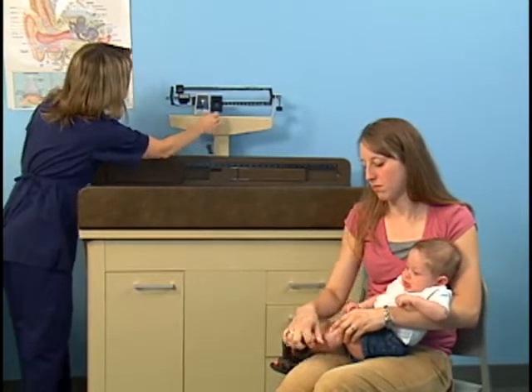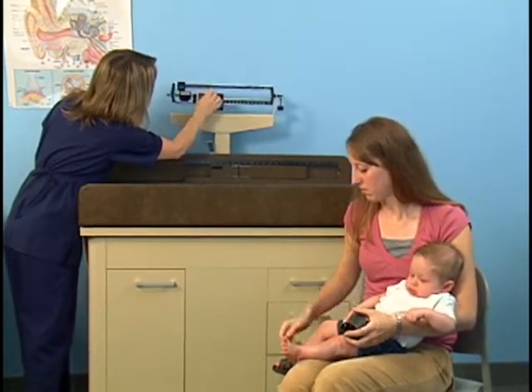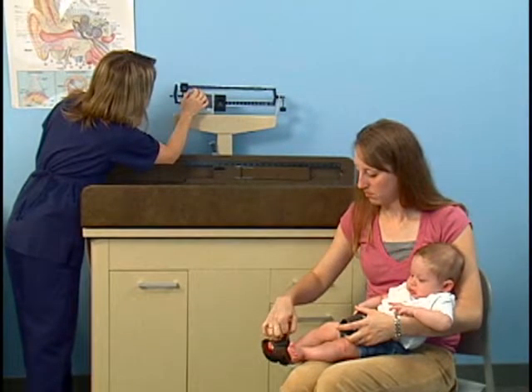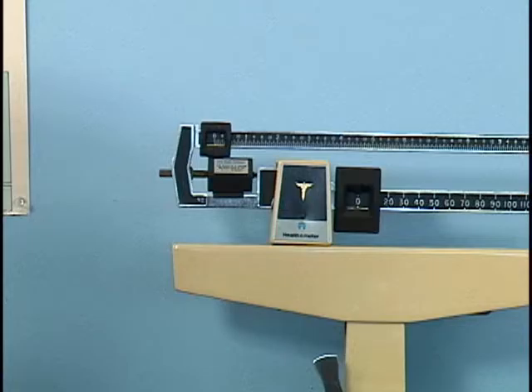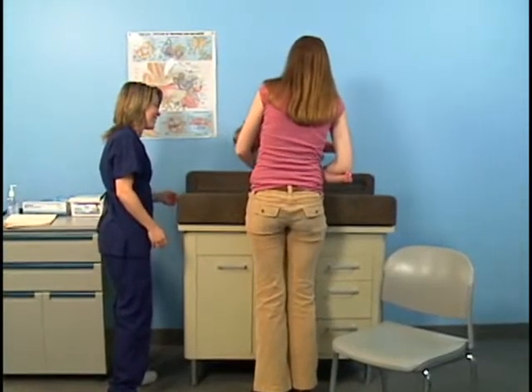You must first check the scale to make sure it is balanced. The weight will be inaccurate if the scale is not balanced. The scale should be balanced with the paper protector in place to compensate for the weight of the paper. The upper and lower weights must be on 0, which is all the way to the left. If the scale is balanced, the indicator point will rest in the center of the balance area.